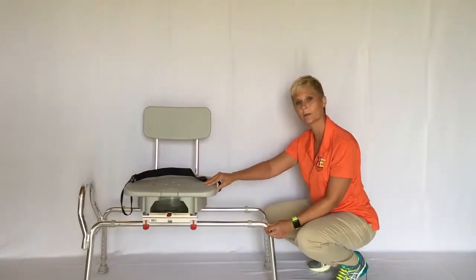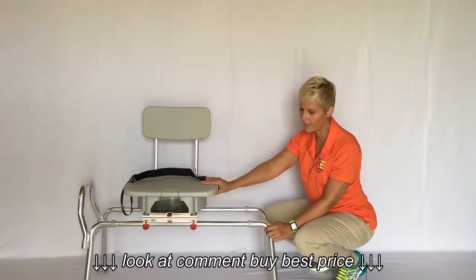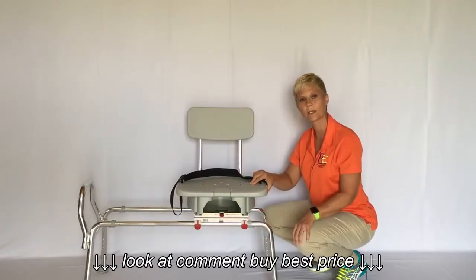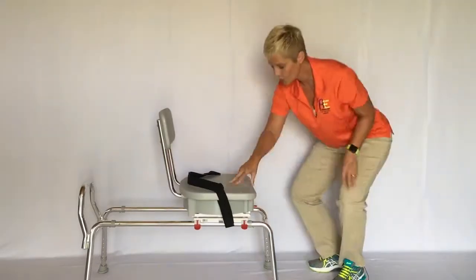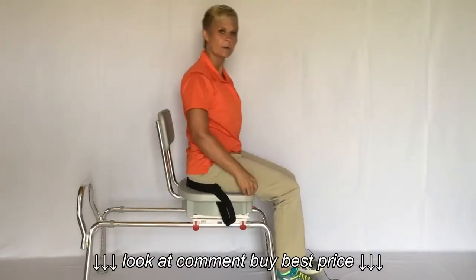It also locks at the other end, and there's another lever on that side to release it when you're coming back. You can hear it lock into place. Now I'm going to show you how it slides across the carriage — if I was going to get into the shower, I would sit down on this seat.